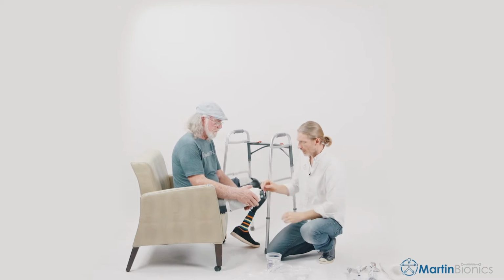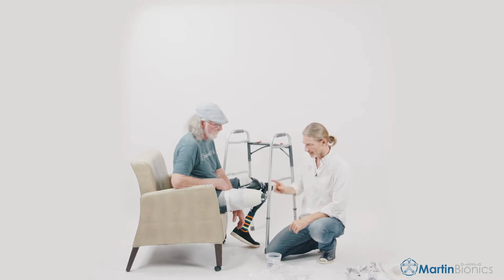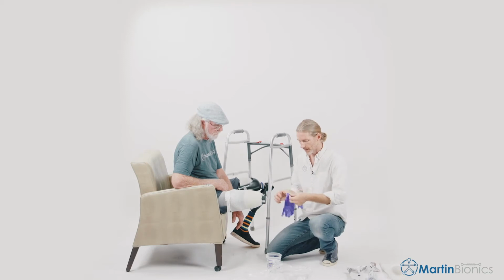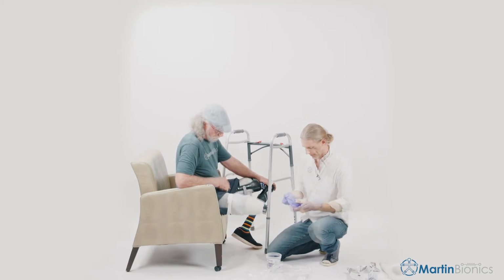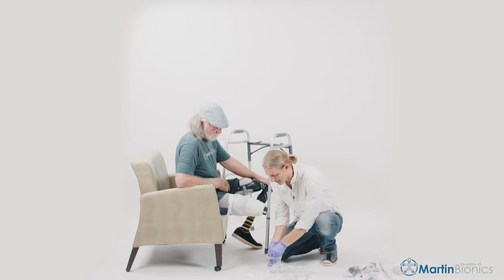There we go. Now, we want to make sure that the end of our liner is as smooth as possible. I have a little bit of a wrinkle here. We'll take care of that in the next, when we take this off after the casting. But let's go ahead and take another cast over this to incorporate it in. Again, I'm using the 3M soft cast material. You don't have to use this, but it makes for a little bit nicer transition at the proximal edge.